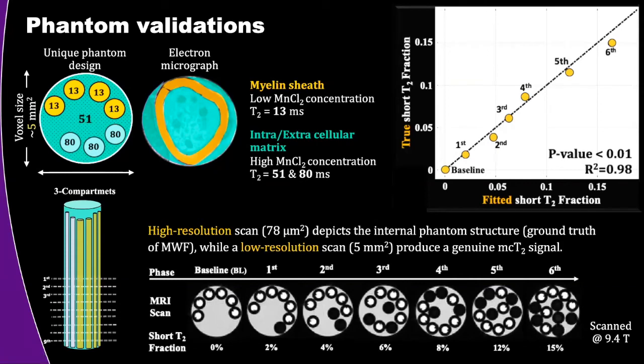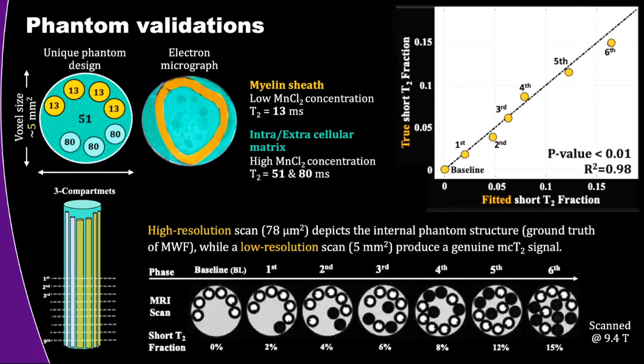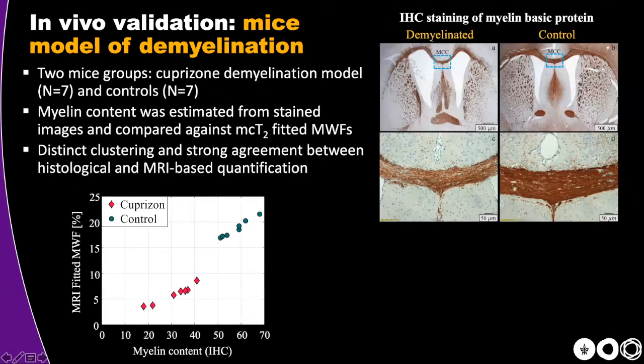I think that you could get clinically significant values that would be useful for studying diseases, even if you get wrong values or biased values. I mean, the fact that they're biased doesn't mean that they're not clinically significant. If we look here at the difference between healthy and demyelinated brains, you could change the values or bias them, and you would still get clinically significant values.